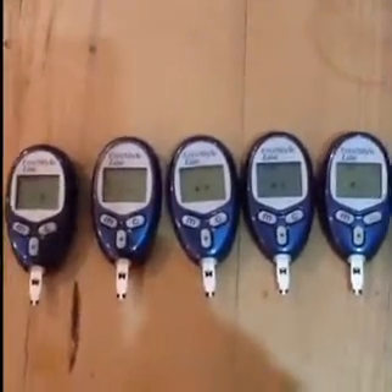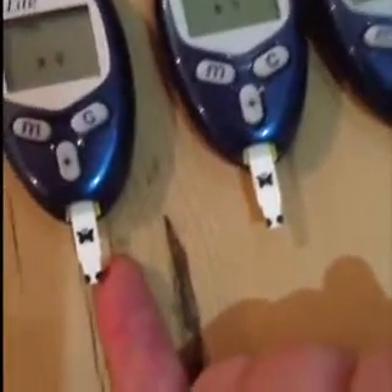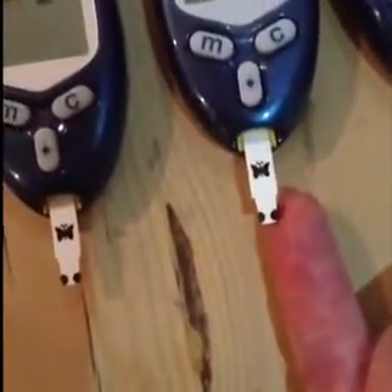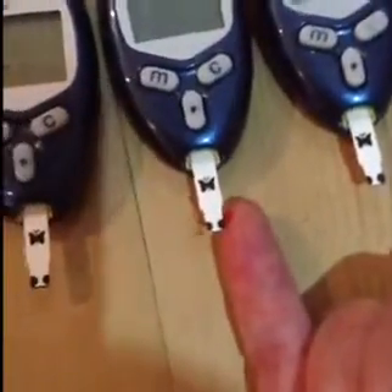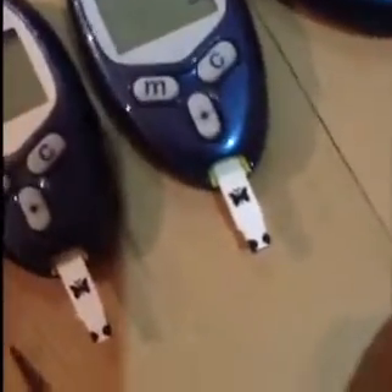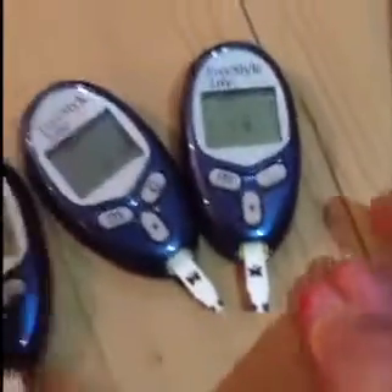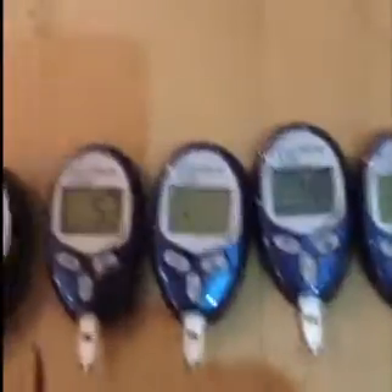I'm going to take a blood sample now. I've pricked my finger and I have a blood sample here ready to go. Let's see what these boys say. This is going to be a bit tricky filming this. Here we go — first one, second one, third one. Running out of blood. Fourth one — we've got a result coming out. Just can't get enough blood out. There we go. Right, so everybody's got some blood.